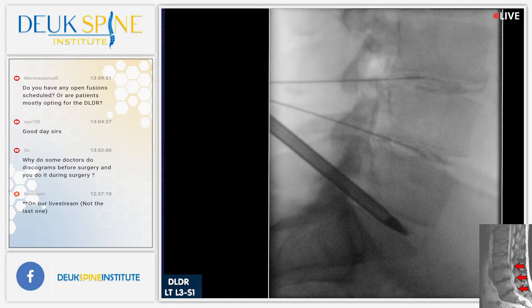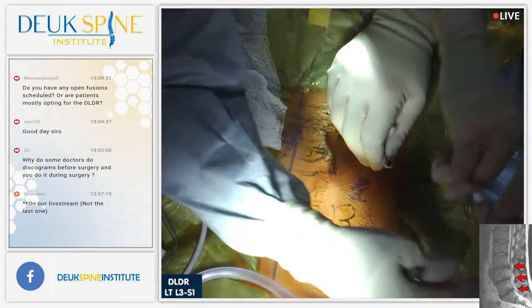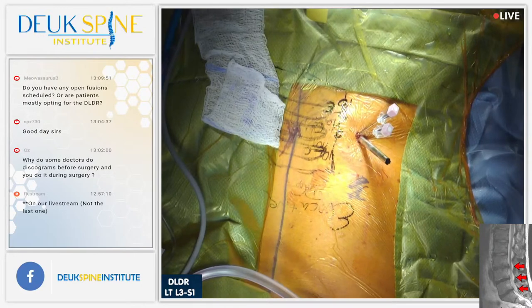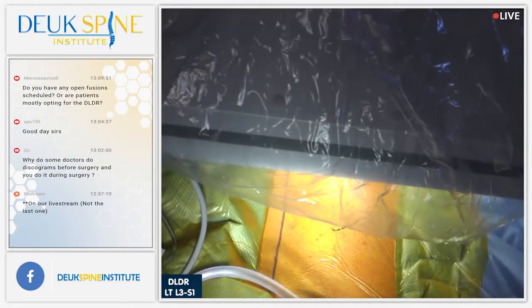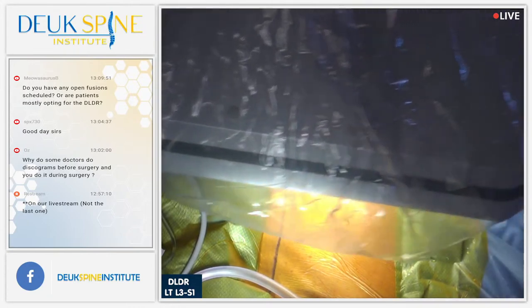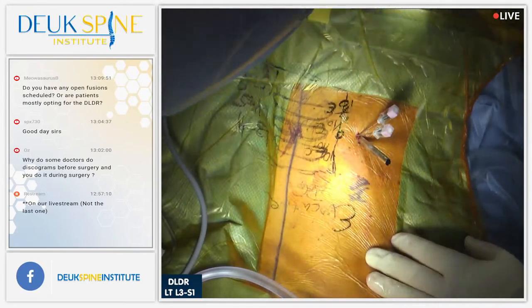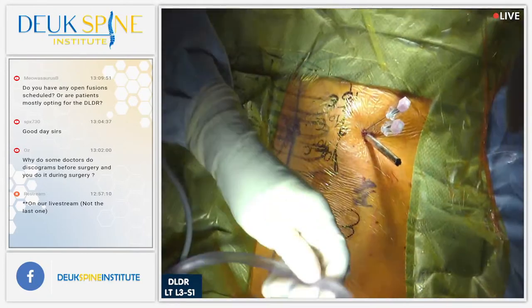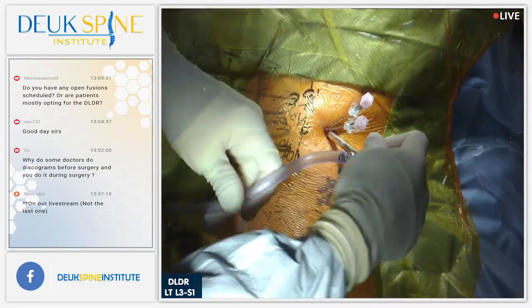The first time I did it, I freaked out. Careful now. You got to come straight out. I mean, watching a patient squirm around a bit, it's a bit uncomfortable for the doctor too, because you don't know if everything's okay. I assure you, everything is fine. After doing 1,600 of these surgeries, and that's just the endoscopic surgeries, I can assure you this is totally normal, par for the course, okay?